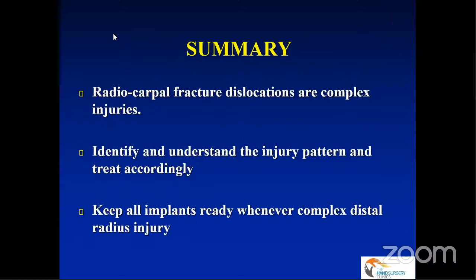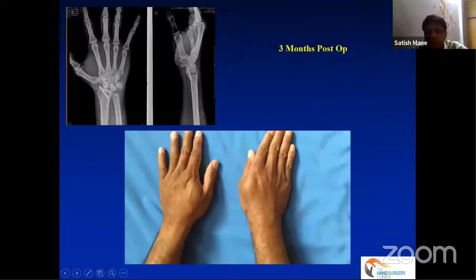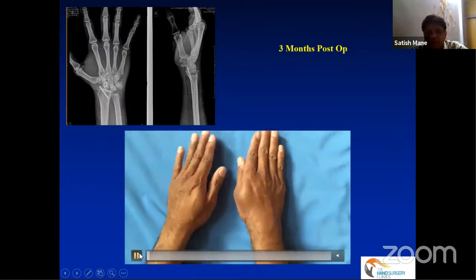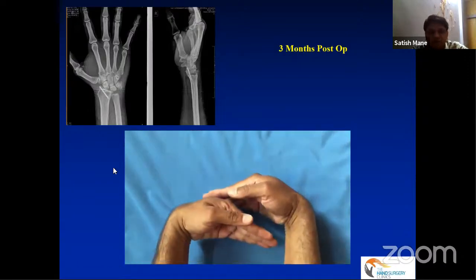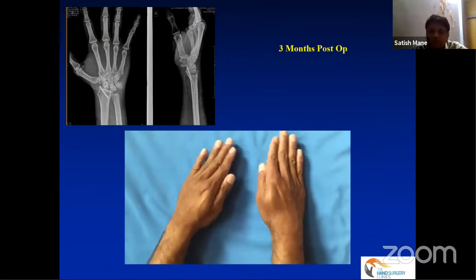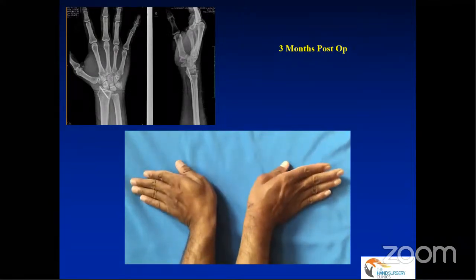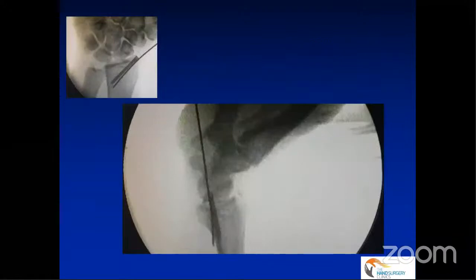Fantastic. I think please show the final X-ray again. Here is the three-month post-op X-ray and the video I just got yesterday from the patient on WhatsApp. So the radial styloid is completely healed, and the video shows his range of motion. Look, even the immediate post reduction and fixation X-ray appeared to show that the carpus seemed to be off the radius. Yes, sir. So this is a radial deviation X-ray.